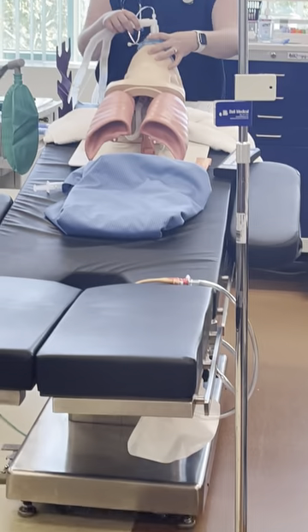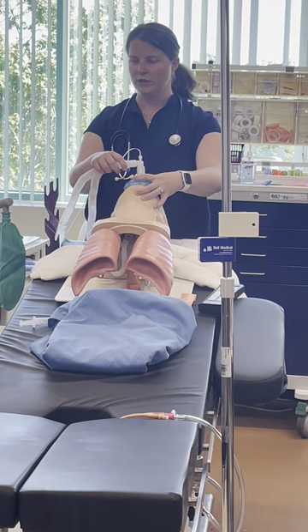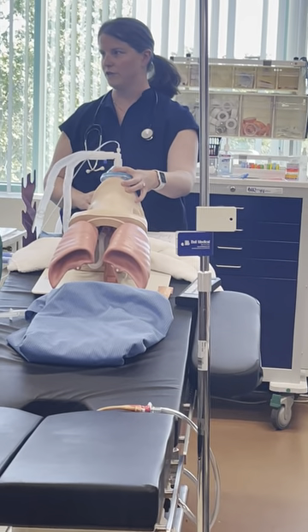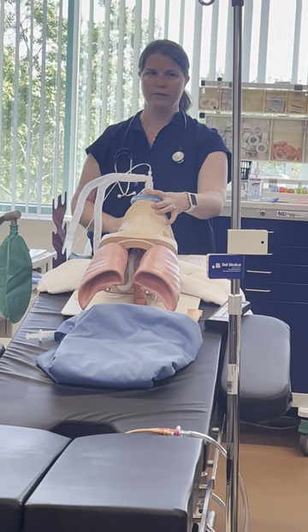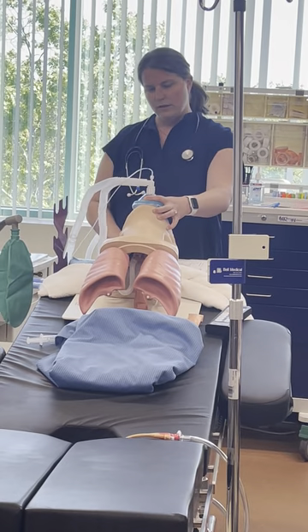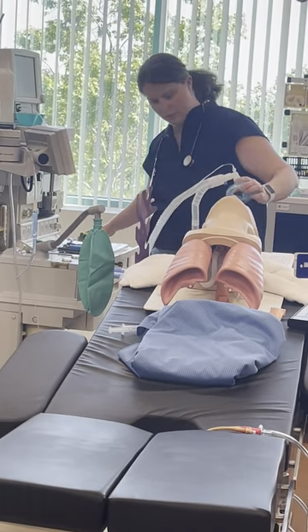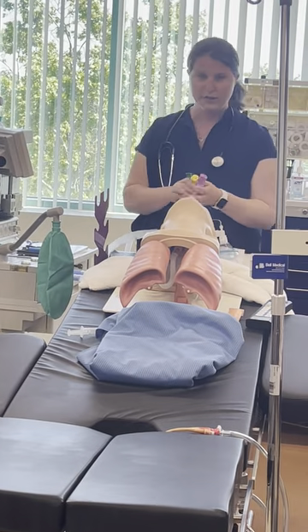Mandible not on the soft tissue. It's really important that when you bag-mask ventilate, your fingers are just right on the bone of the jawline.